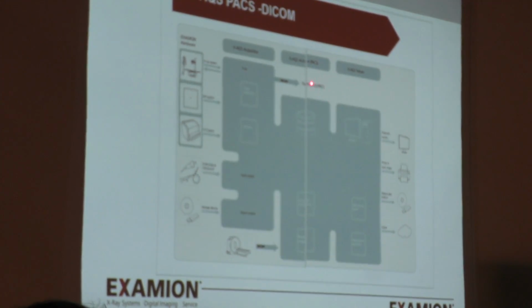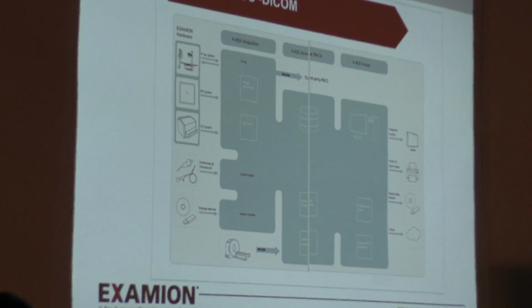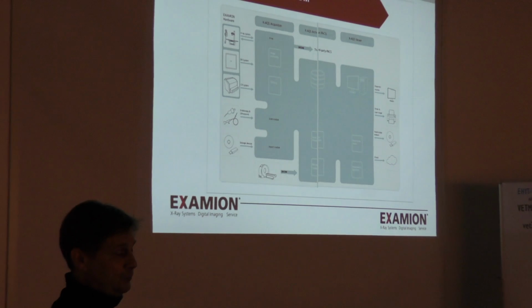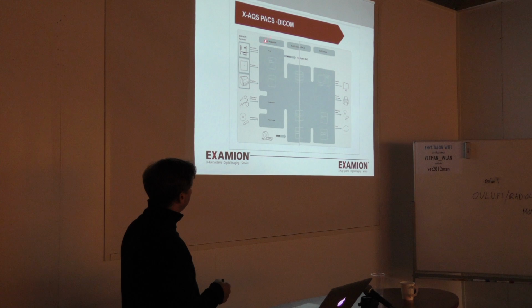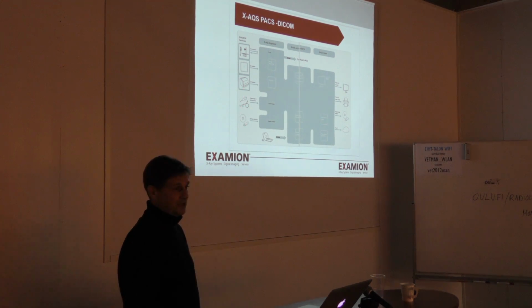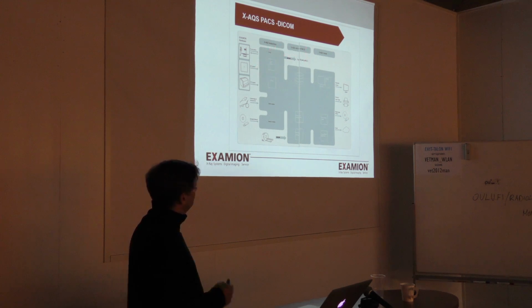You may already have a PACS software and computers where you can view digital imaging, whether ultrasounds, endoscopes, video films, X-rays, CTs, MRI. If you already have that, then you can go in with a simple acquisition software and a digital component, whether that's X-ray or CT or scopes or any other devices. You can come as a simple acquisition part into an existing PACS.